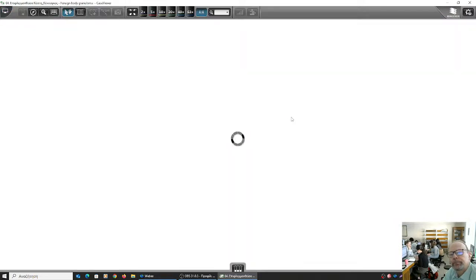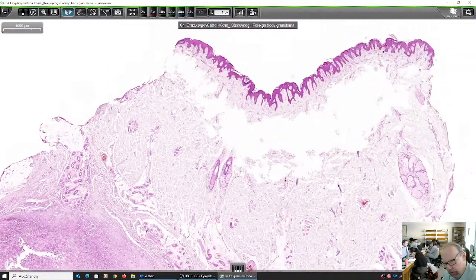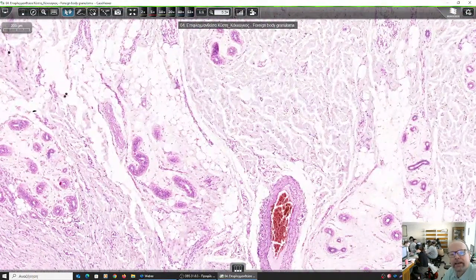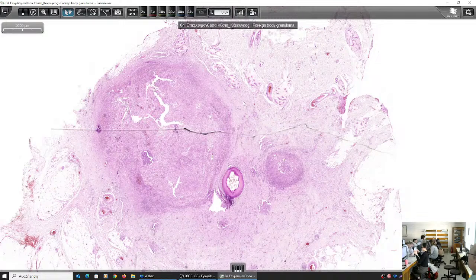Next one. This is an inflammation taking place here under the skin. You see the squamous epithelium? And here are sebaceous glands, hair follicles, and eccrine glands, sweat glands. Now, how do you recognize the inflammatory area? There are many, many dots, because that's how inflammatory cells look.